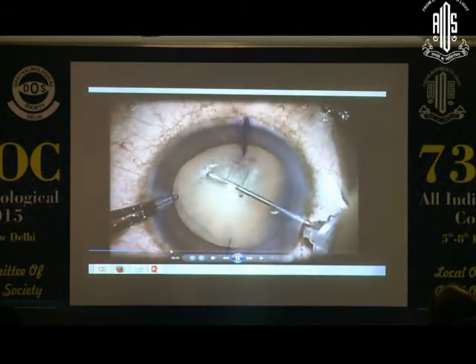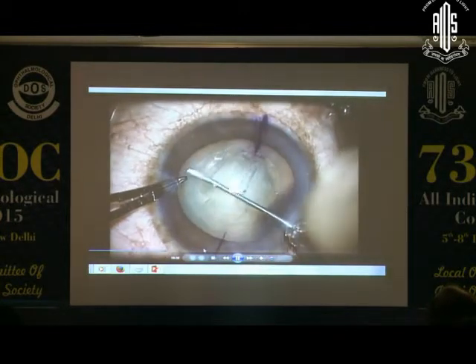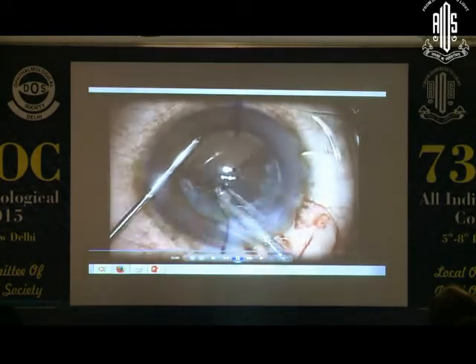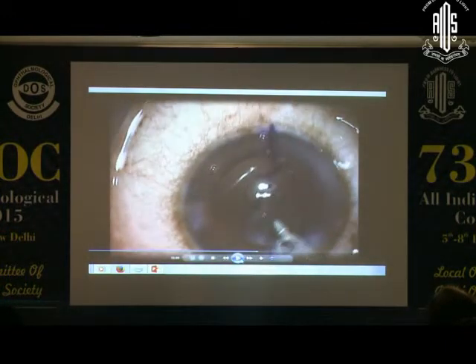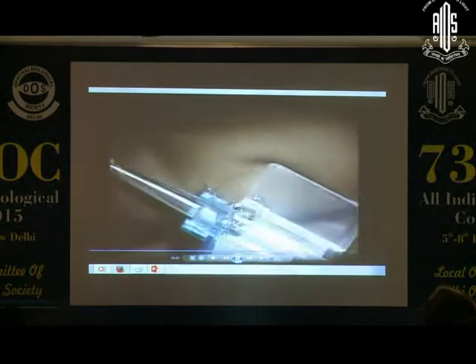The rhexis has to be as central and as circular as possible. I'll just skip through the regular phaco part. You remember that the bag should be completely emptied and free of all cortex in all areas, because if you leave a small amount of cortex in one part of the capsular bag, that part can contract unevenly and cause displacement of the IOL later. So take care that the bag is completely empty.